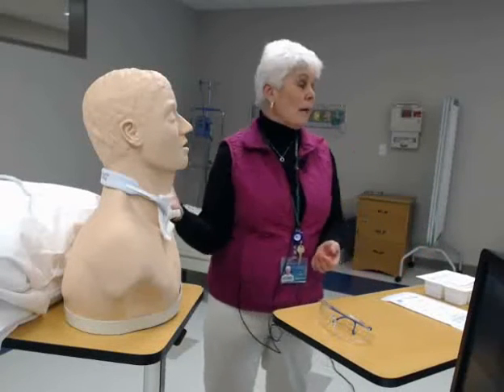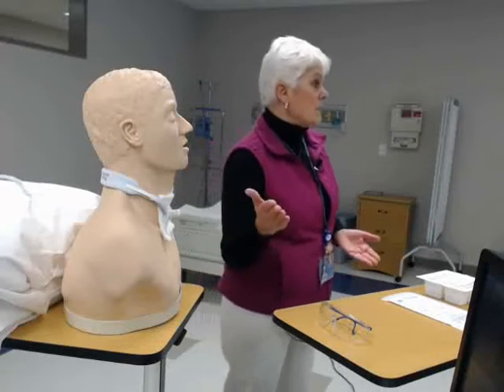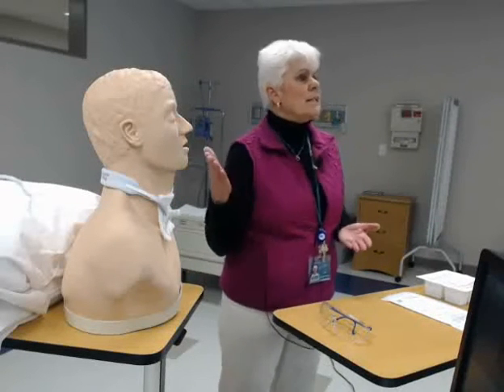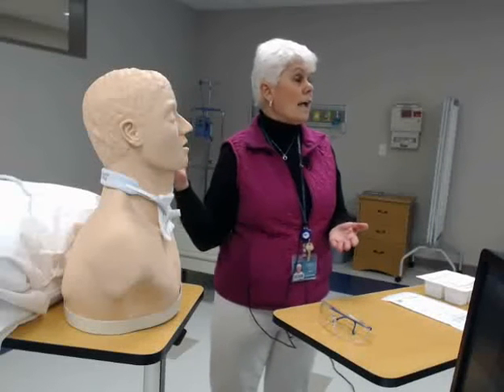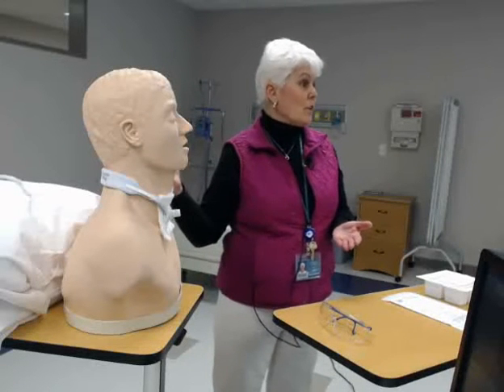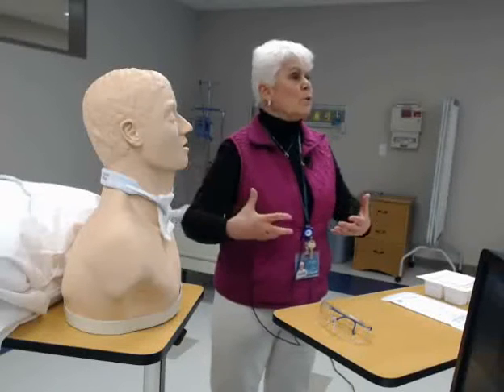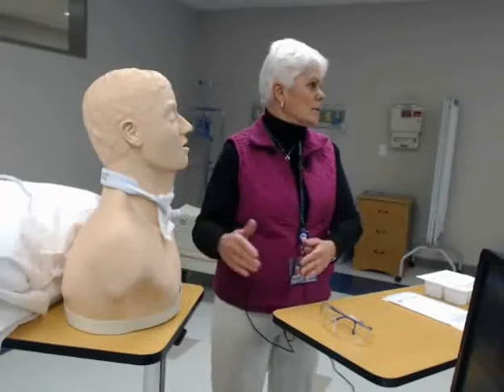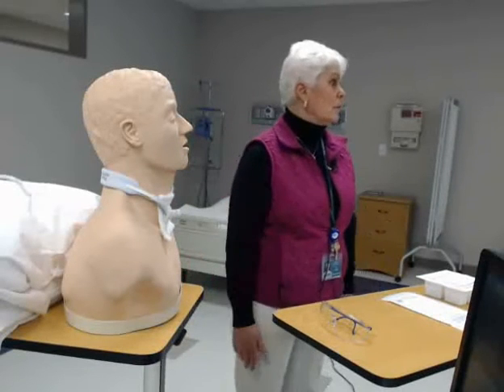You're going to assist the patient into an appropriate position for this care — a semi-Fowler's or Fowler's position. That will help expand the lungs. For our purposes, I just have this mannequin sitting up so everybody can see.